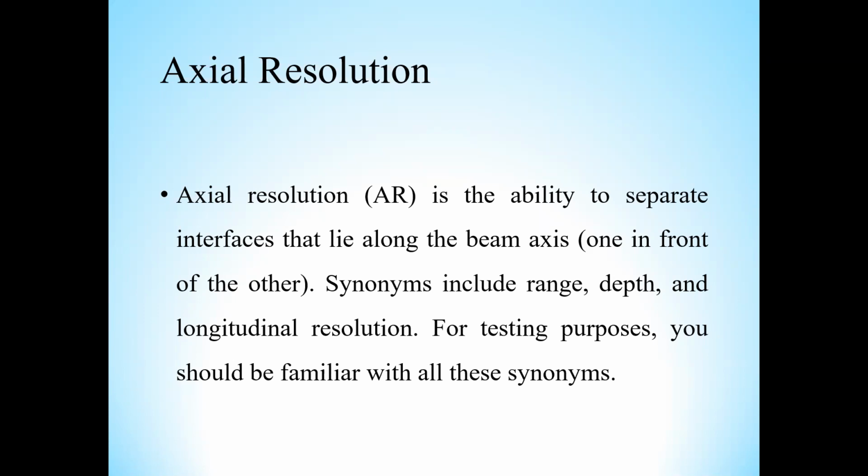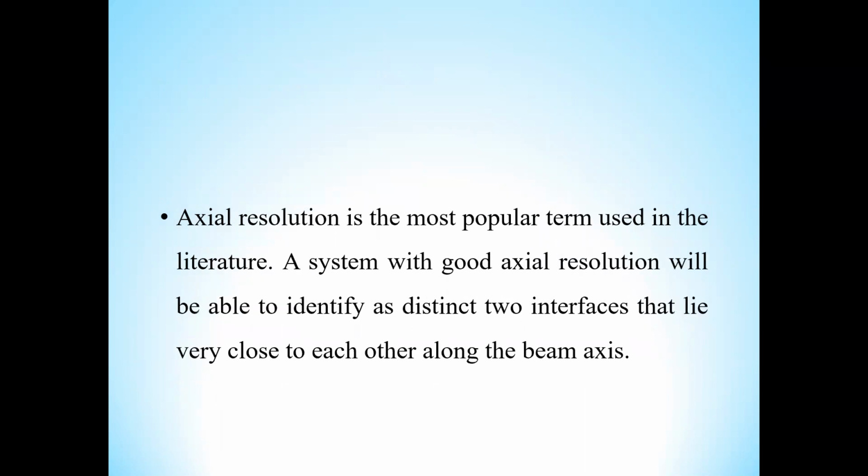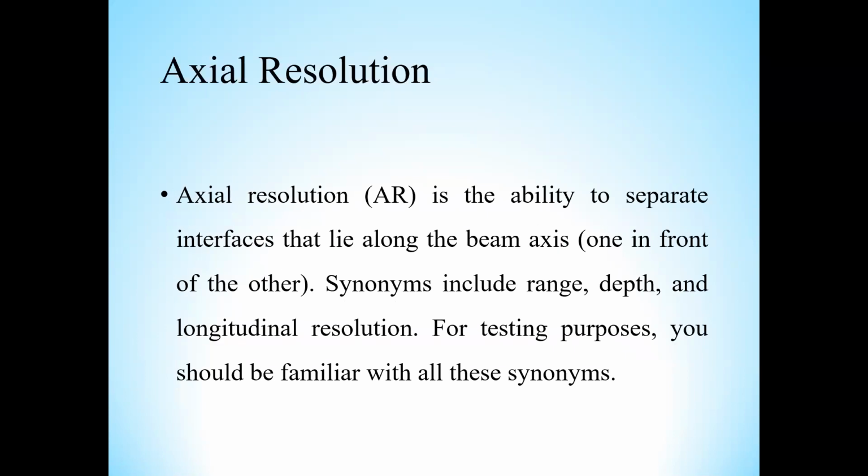And that axial resolution depends upon the SPL. Do you remember about SPL? What is SPL? Spatial pulse length. SPL means spatial pulse length.